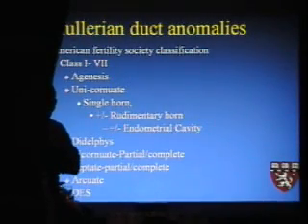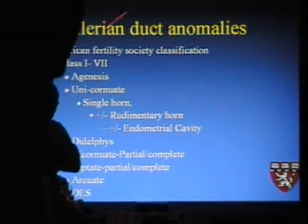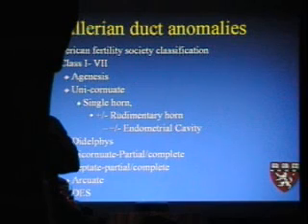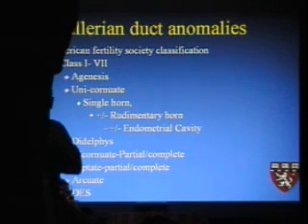So let's just go now through some of the common reasons why we do pelvic MRI first. One of them is these Müllerian duct anomalies. And hopefully you're familiar with the classifications, but these are the list of them now, and they're classified according to the American Fertility Society as 1 through 7, as you can see here, through agenesis being number 1, unicornuate uteri, where only one system has developed, has a bunch of different varieties.